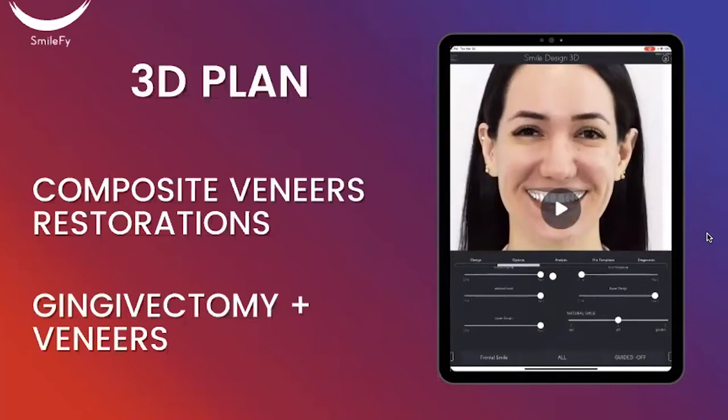because even though the patient liked the idea on a simulation, I still need to respect my patient's desires. So I decided to create two types of dental wax-ups using the same patient's files. And then the other one was the gingivectomy with the veneers.